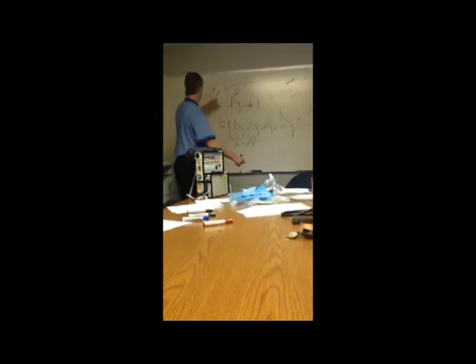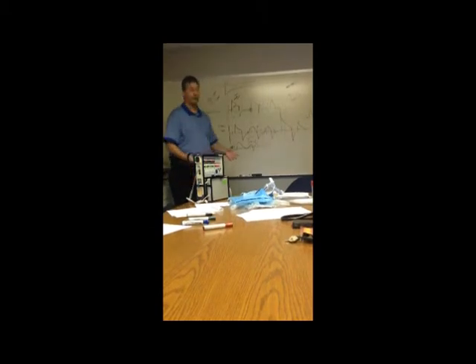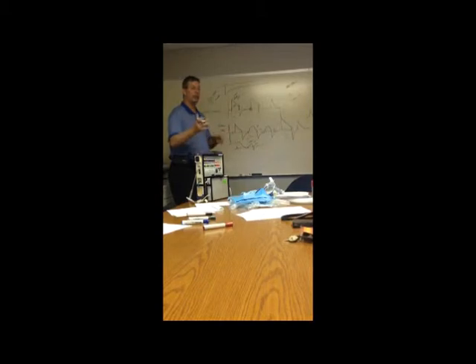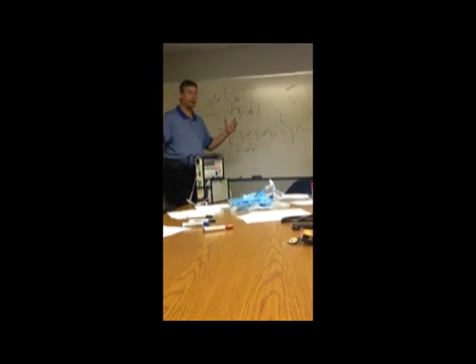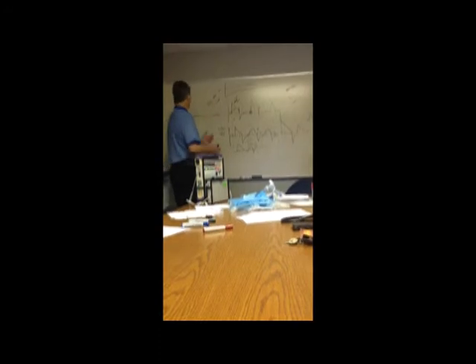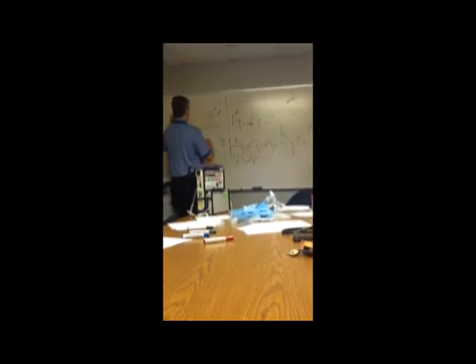And in a lot of cases, which is where it started with sleep apnea, that bottom number is a lot higher because it's used to stent their airway open. But in somebody breathing in distress, you're not doing it for that. So we don't use the same numbers as you would with that. We use it more for holding their alveoli open. So every breath when they exhale, their alveoli don't slam shut, and then we've got to pop them open on the next breath. So they tend to oxygenate better.